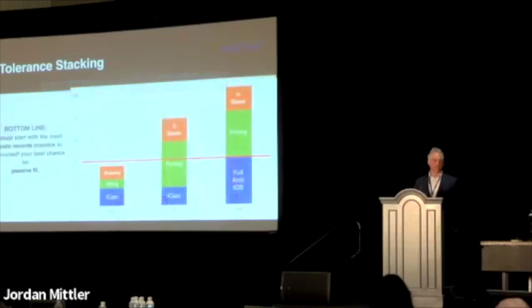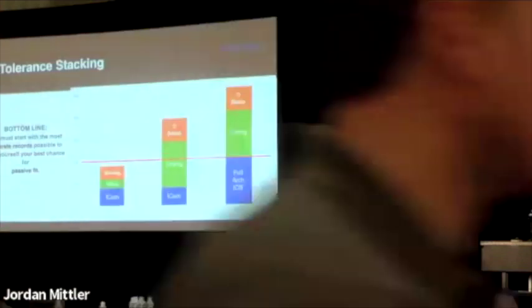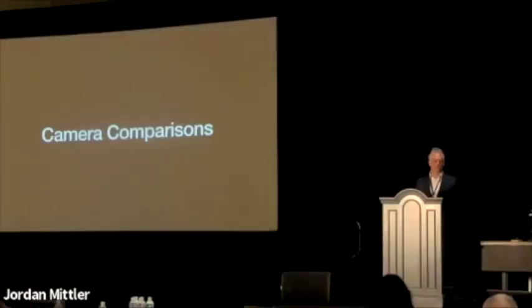So when you stack them all together, you want to start with the most accurate thing possible. If your goal is to be within 100 microns, then I want to start with the most accurate thing possible, because when I introduce milling and sintering, I want to be below the 100 micron threshold. So just keep in mind that this stacks up, and this is just one part of the restorative process.